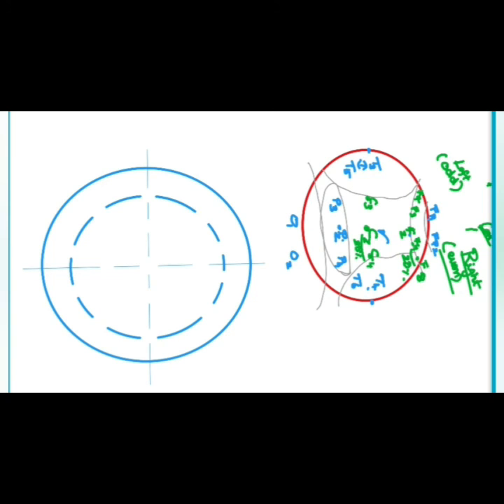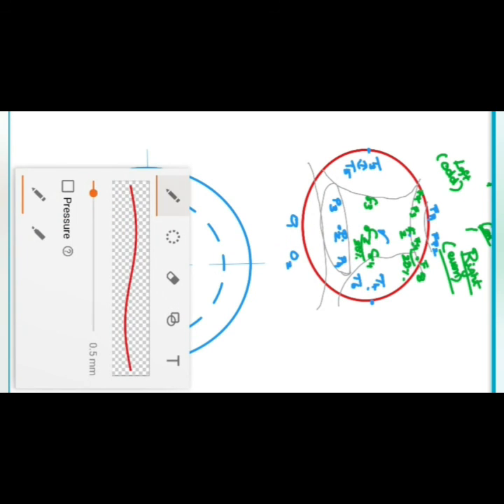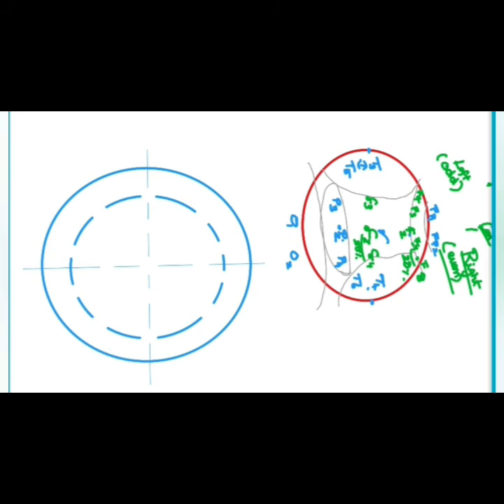So the previous diagram was a little clumsy, so I'm going to redraw a diagram. What I'm doing is using a standard format, a presentable one, right? So same way I'm going to place the electrodes. First I'm going to start with CZ. On the right side, 20 percentage difference, so C4. On the left, 25 percentage, sorry, 20 percentage, so C3. That's it, center is done.